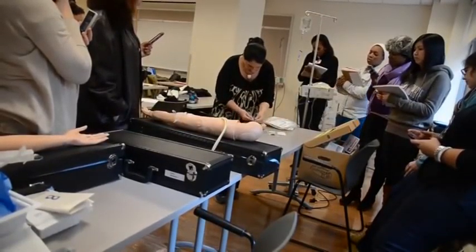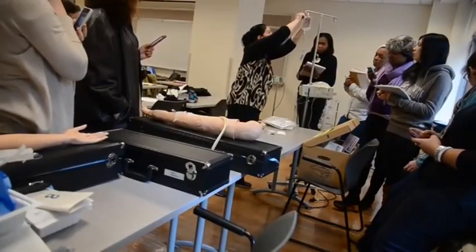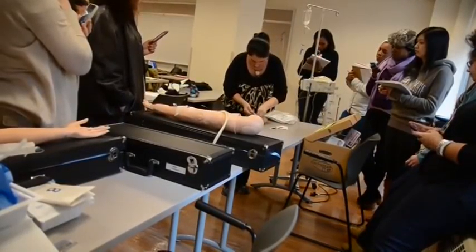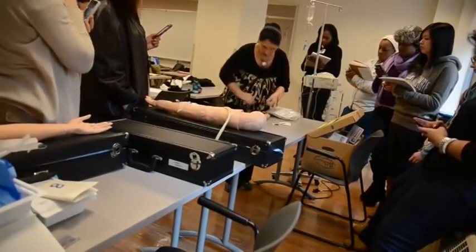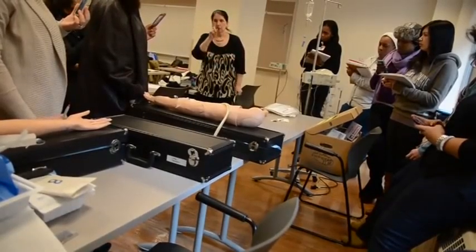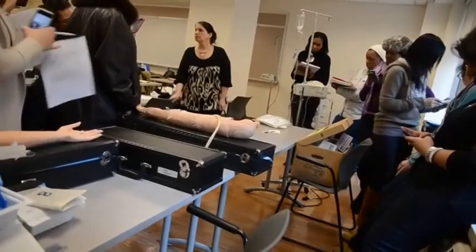So I'm going to have my saline flush ready. I closed it, I disconnect it. Clean it, attach it, open it, flush it, close it, remove it. So that's your second flush because my IV was done. Now, you're not going to need the flush for number two, three, and four. You only need it for skill one — saline lock number one, because that one was IV piggyback.